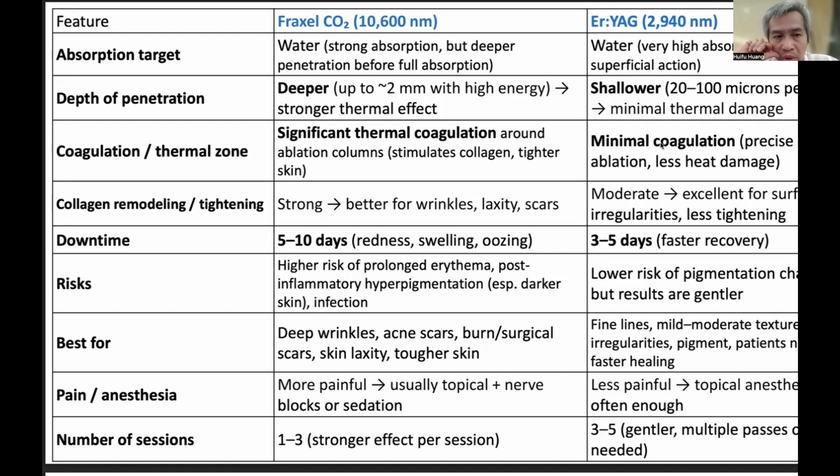So the recovery time, the so-called downtime, is a little bit longer. It requires up to 10 days when the patient receives a Fraxel laser. If the patient receives an Erbium YAG laser, the recovery time is a little bit faster, requiring 3 to 5 days. So it's a little bit different. The stronger the energy, the more severe the injury of the tissue. Next slide.